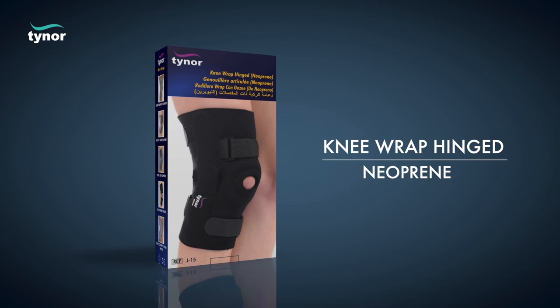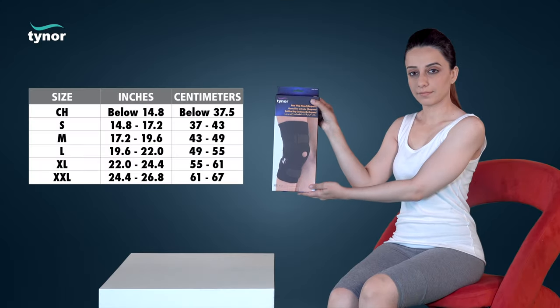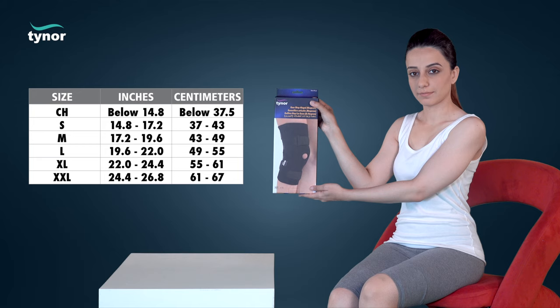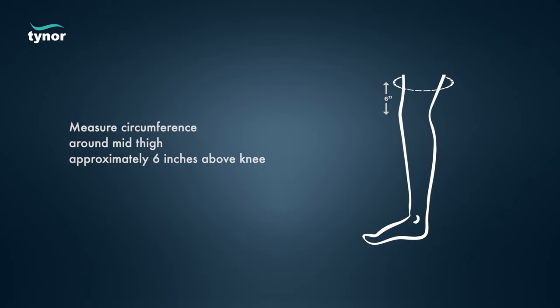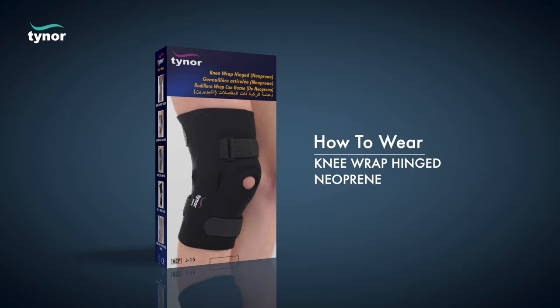Here we will discuss how to measure the size and how to wear the knee wrap hinged neo. The knee wrap hinged neo is available in these sizes. Measure circumference around mid thigh, approximately six inches above the knee. Now let us see how to wear the knee wrap hinged neo.